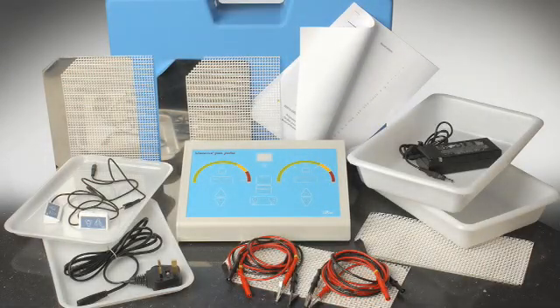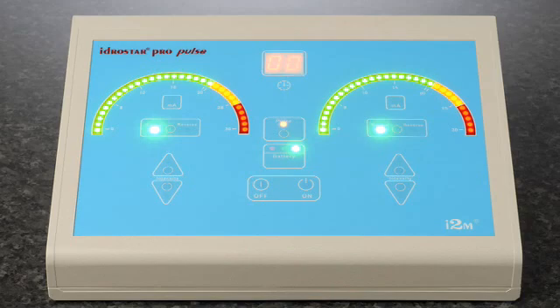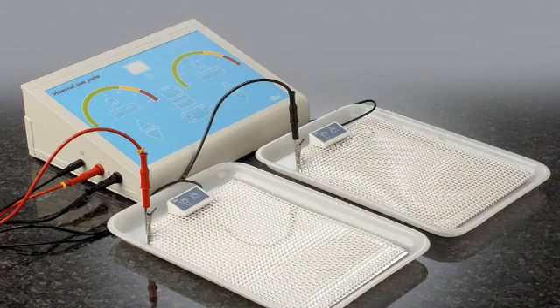The Idrostar Pro Pulse machine that you have bought is for the treatment of hyperhidrosis of the hands, feet and the axilla or armpits. It should not be used if you are pregnant, have a cardiac pacemaker or similar device, or if you have a metal orthopaedic implant.